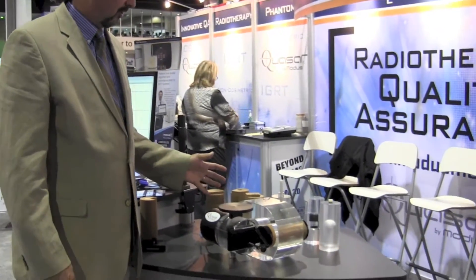Hi, I'm John Miller at Modus. This is the Respiratory Motion Phantom that we're showing here at Astro.